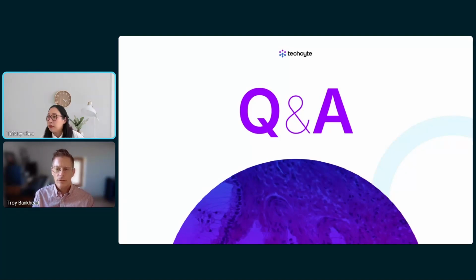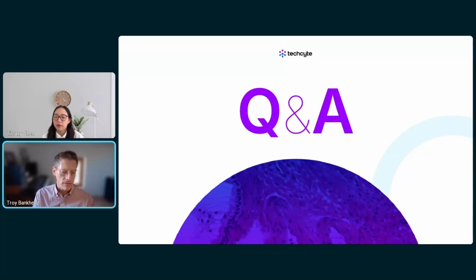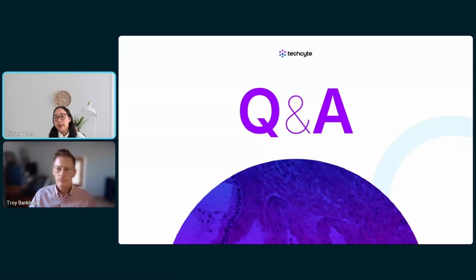We've got another question from Sharon, who asks, what does onboarding look like for a lab wanting to go digital with frozen sections? Yes, that's a great question. If a lab is wanting to go digital for frozen sections, this will be similar to a discussion on just a lab going digital in general. So you will have to look at what scanners best fit your current workflow and your volumes. And then for us, once we've identified what types of volume you have, what types of scanners you would prefer, then we can set this up to start.